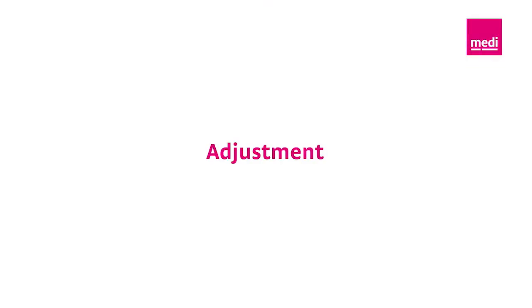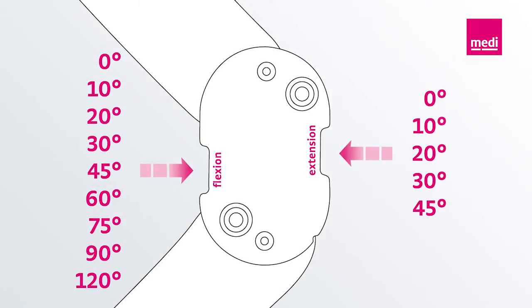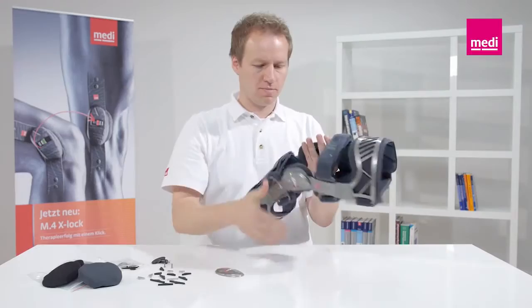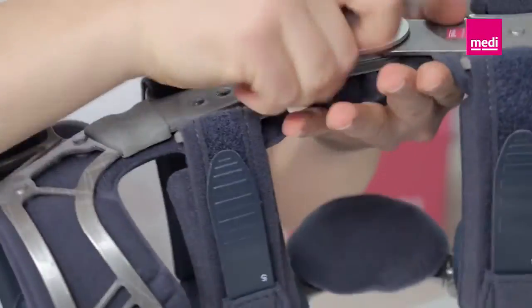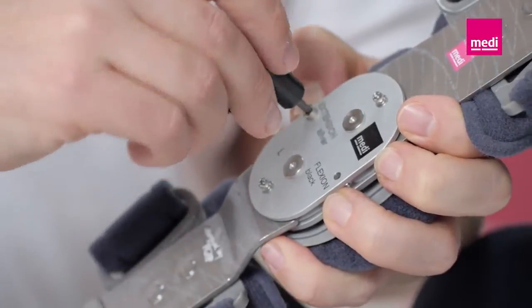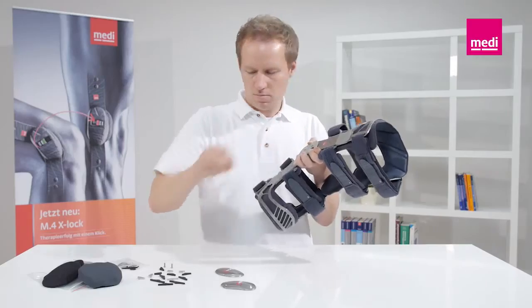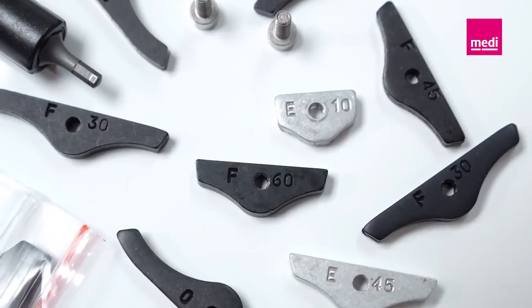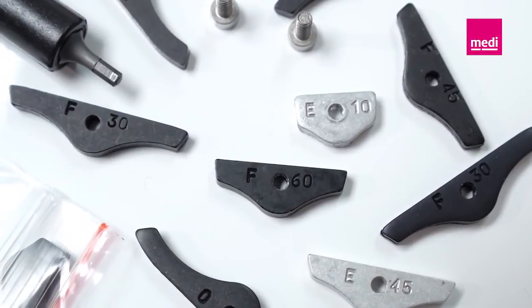The knee orthosis can now be adjusted. Zero-degree extension wedges are pre-installed in the M4SOA. The wedges define the radius of movement of the knee. To set the limits of extension and flexion, please first remove the side covers. Now undo the screw and pull the wedge out. You will find the replacement wedges in the wedge set. The engraved description helps you find the correct wedge.